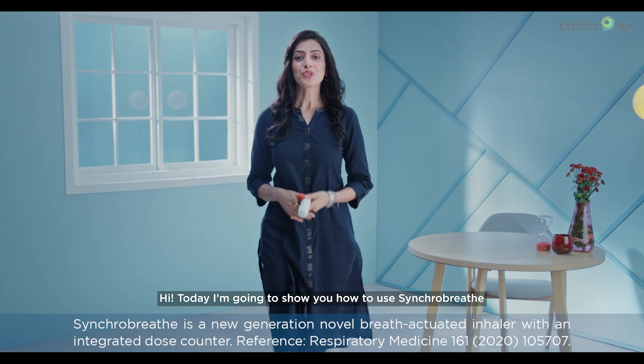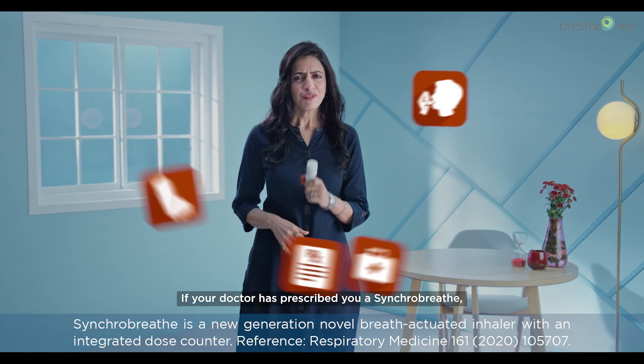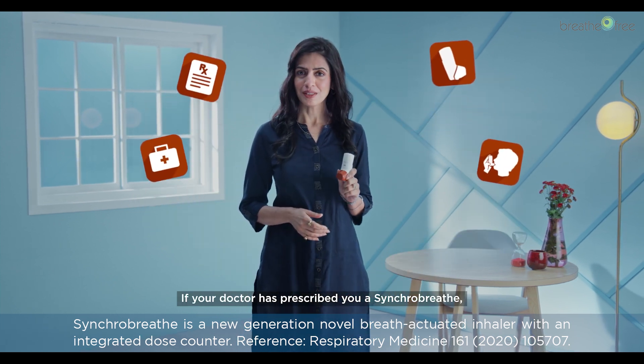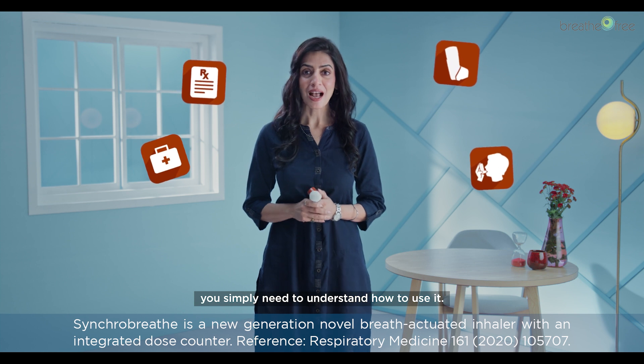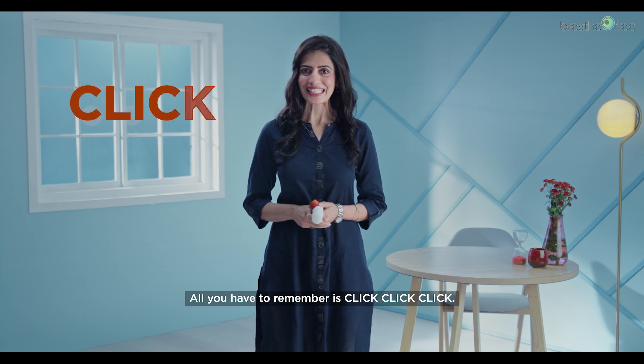Hi, today I'm going to show you how to use SynchroBreathe, the new generation inhaler. If your doctor has prescribed you SynchroBreathe, you simply need to understand how to use it and we will help you to do just that. All you have to remember is click, click, click.